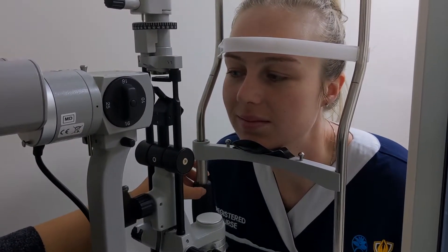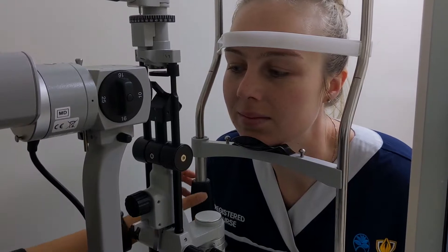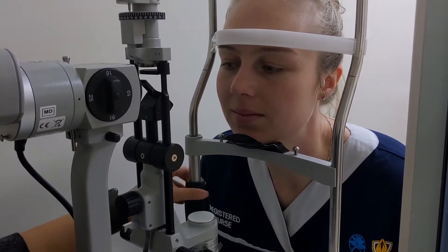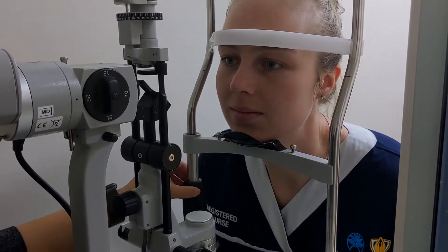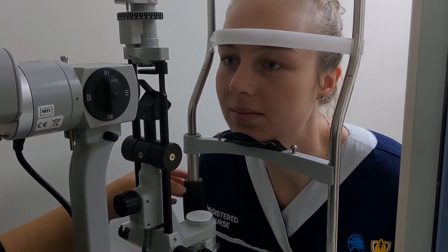If you want to move the chin rest up and down, you'll be twisting it — clockwise to go up and anti-clockwise to go down.